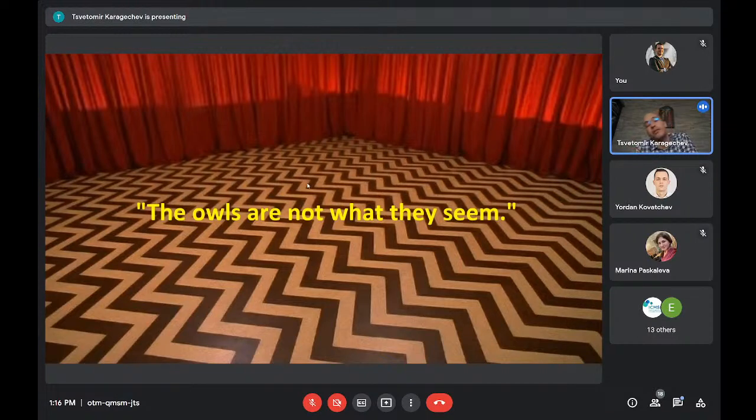And when I started my radiology residency, I found myself very often thinking about this quote when looking at images, because as you can see in the next case that Dr. Kovatchev has prepared for you, the things that we see are very often not what we think at first. Dr. Kovatchev?